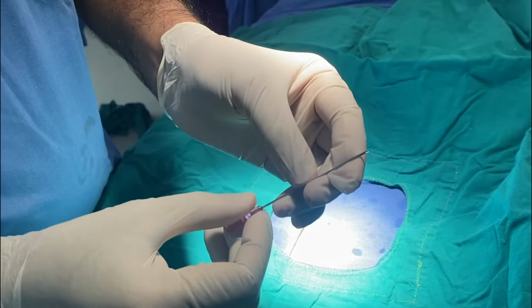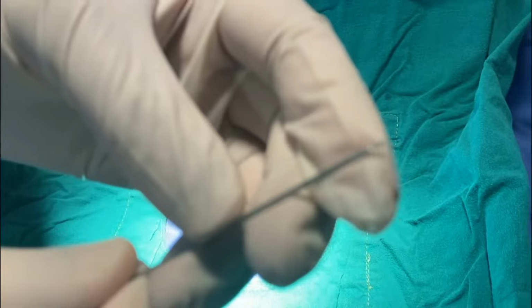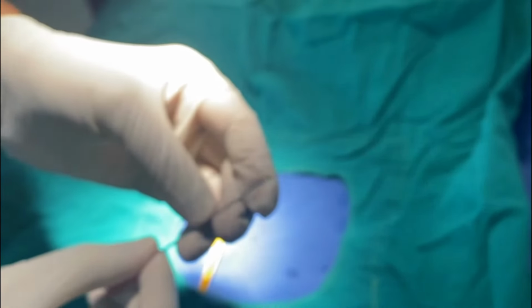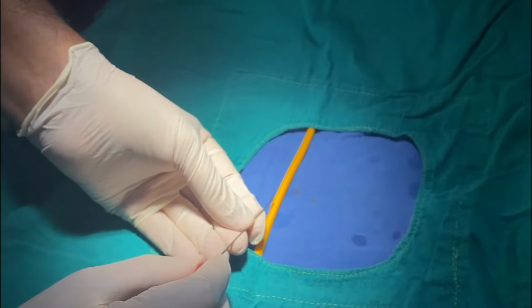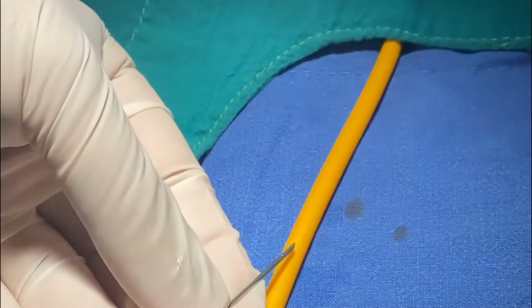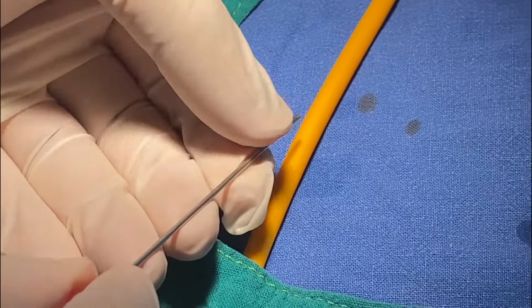This is the femoral puncture needle. It has got a bevel tip. Can you see the bevel tip? Yes. Okay. So the idea is that the bevel tip should always face upwards, not like this or not like this. Clear? So it should always face upwards.